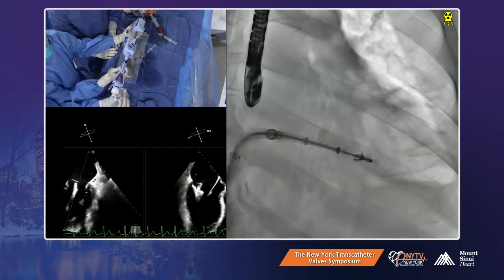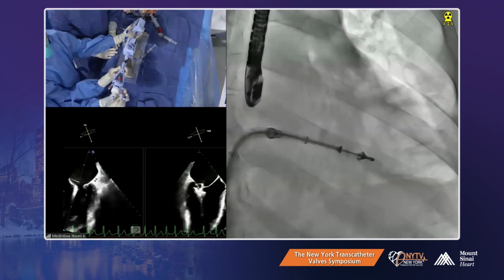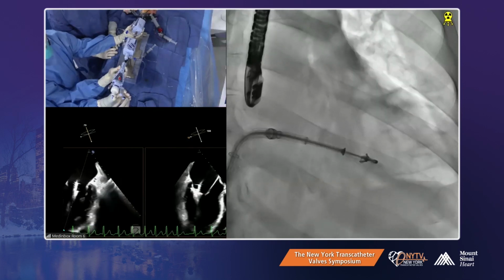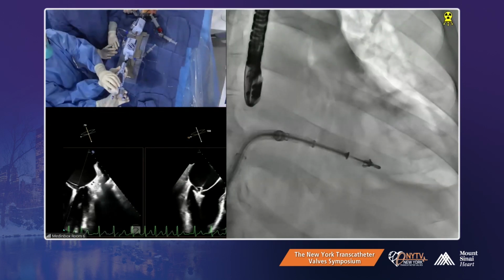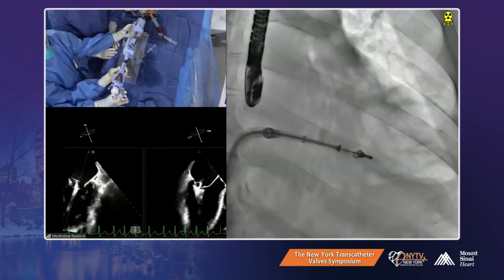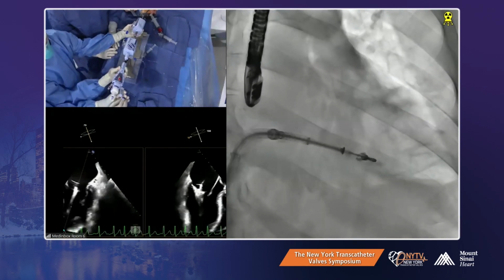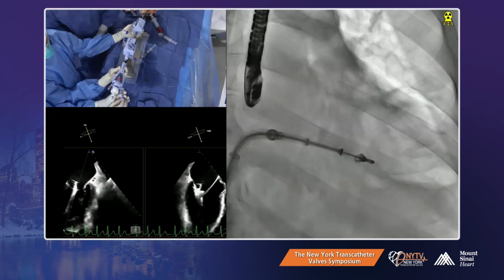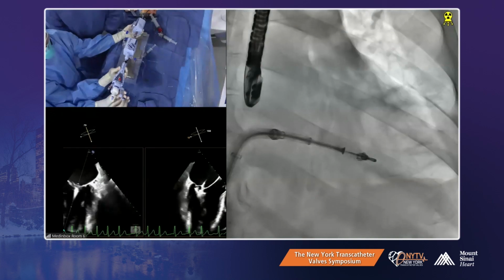Good. Okay. Posterior is second down, right? So how often do you ever do a posterior puncture when you have puncture regret? I've never seen it. You somehow just work through it. Not much of the posterior, unless you're really far away.